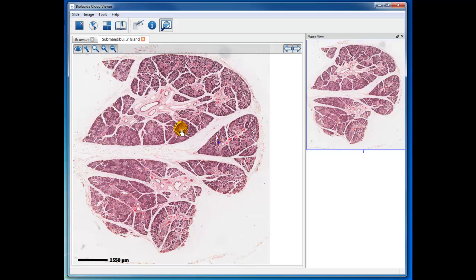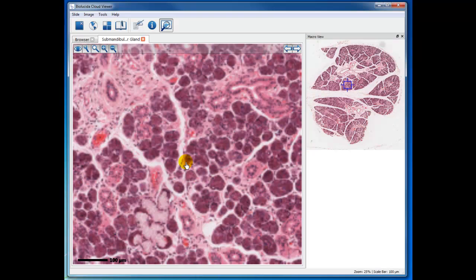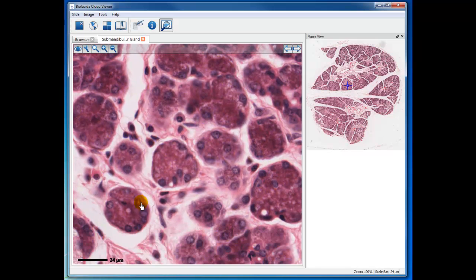So if we zoom in on, let's say, any small lobule, we should expect to find a majority of serous cells, and that's what these are here, with a rather round nucleus and eosinophilic granules that contain the salivary amylases and various enzymes that you're learning in lecture.